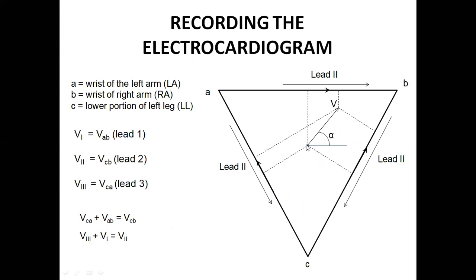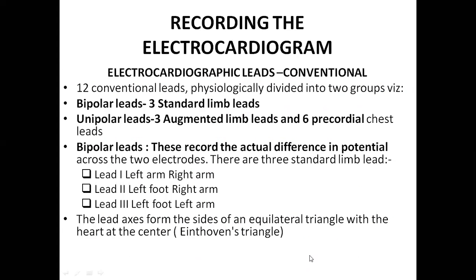Sorry, this is the heart, the position of the heart, and this is what? This is the left arm. Okay, this is the right arm, and this is the left leg. Okay, so we will get back to this.